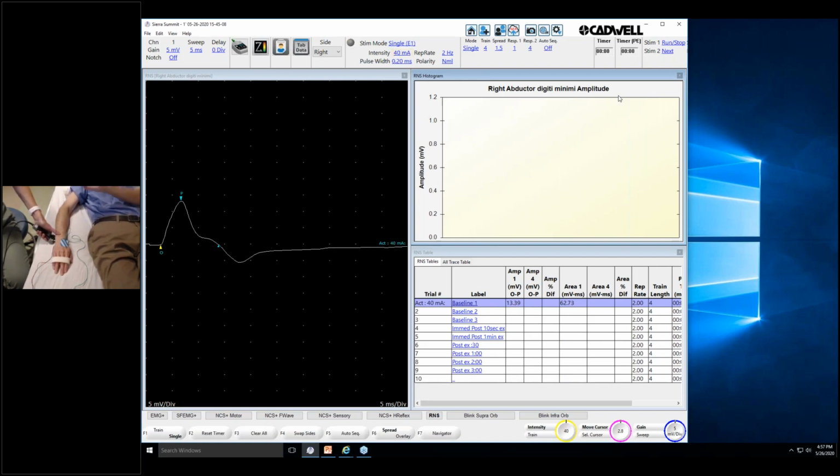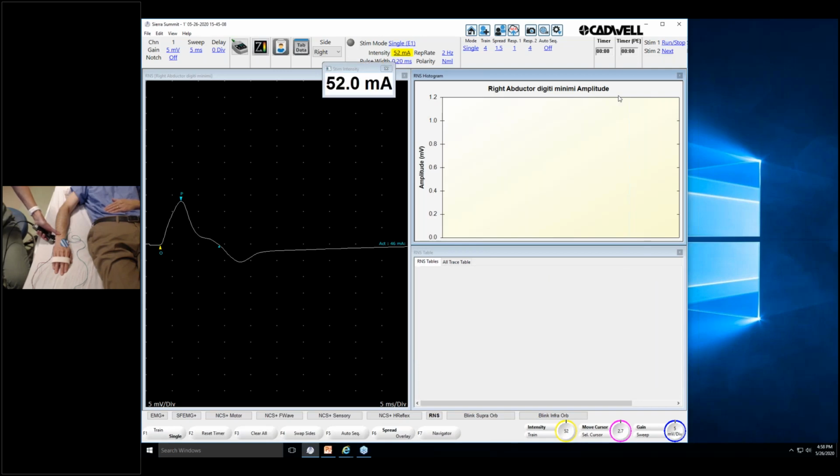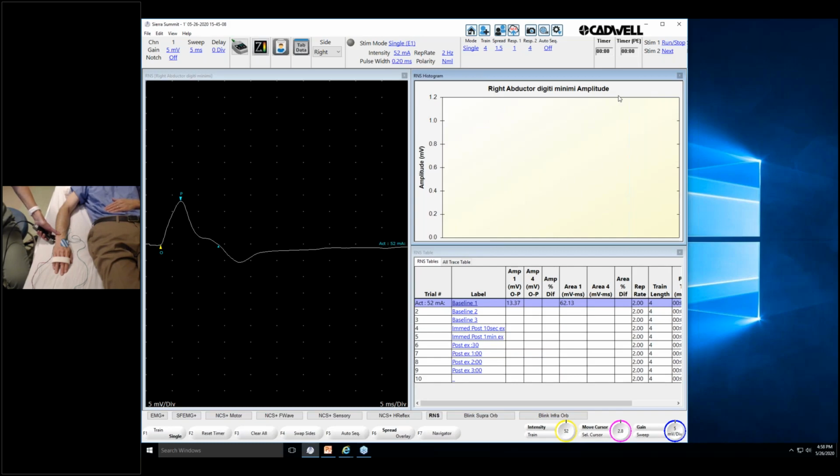This is an important point, so before you give the 4 shocks, I'm going to reiterate it. If you're submaximal or just at threshold of maximal, and the patient moves or the stimulator moves a little bit, the current may not depolarize all the axons, and that's going to drop the amplitude. So you really need to make sure you're supramaximally stimulating the nerve. You could argue, why not just give 100 milliamps? But you also want the patient to be comfortable, because you're going to be giving multiple shocks, and you don't want to give too much stimulus. Once you think you're maximal, go up another 5 or 10 milliamps and give another shock to make sure you're truly supramaximal. So we're going to continue to go up. Okay, I think we've got the whole nerve depolarized now. So we're going to go ahead and give a train of 4.